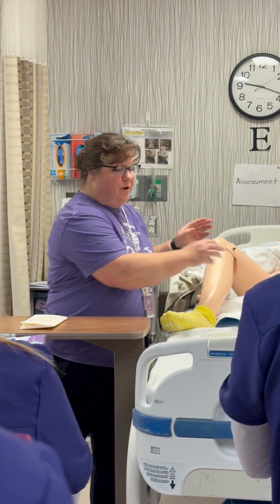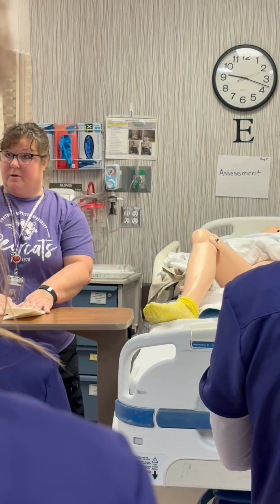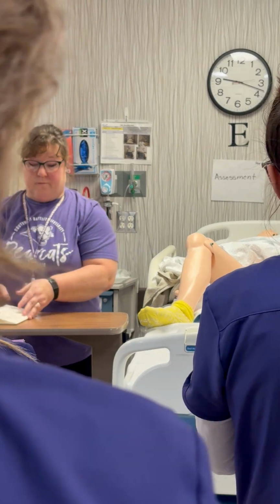So right now, I'm going to show you how to take those gloves out and open up your sterile gloves, okay?